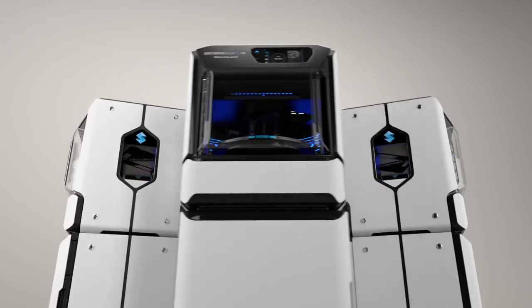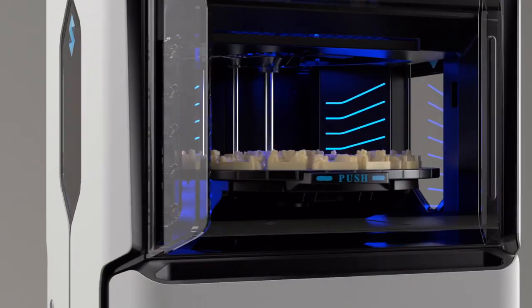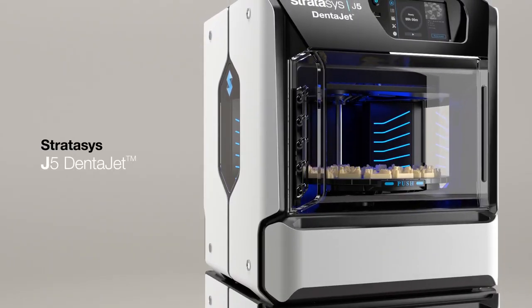All lab types, all in one tray, all of the time. The newest addition to the Stratasys dental family, the J5 Dentajet is the all-around dental solution.